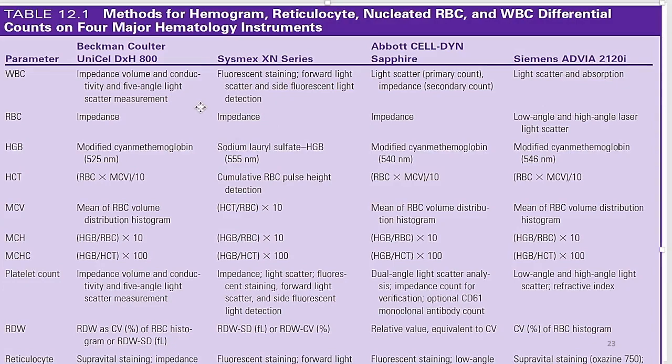These are actually the different principle na ginagamit ng mga different machines. So, ito yung Beckman and Coulter, your Sysmex, your Abbott, and your Siemens. Ito yung different na mga machines or brand manufacturers ng ating mga analyzers. Ang pinaka-common na naka-encounter, of course, na-encounter ko nitong apat na to na different hematological analyzers. Pero pinakasikat talaga is yung Beckman and Coulter kasi sila talaga yung nag-umpisa sa lahat. So, dapat nakalagay dito ang mga different parameters na detect ng ating different manufacturers, no?